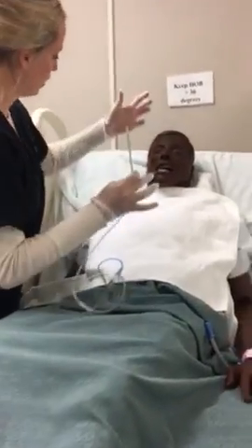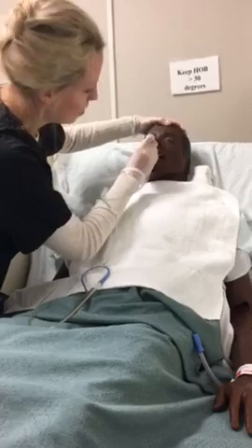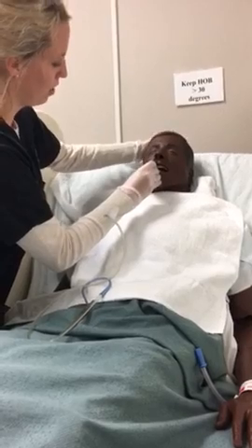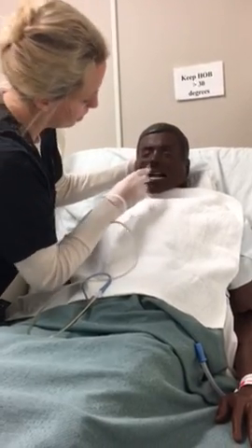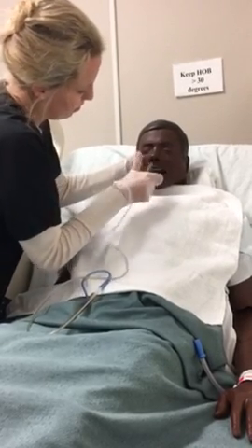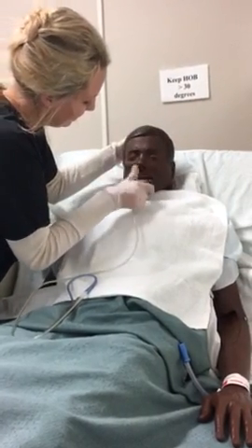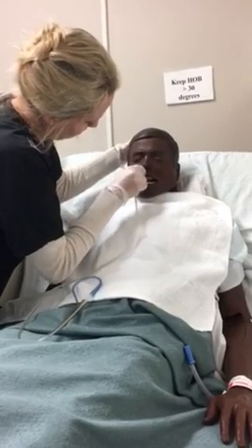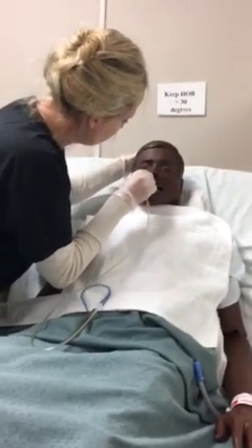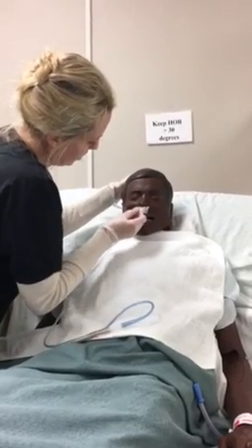I'm going to have the patient tilt their head back, and then I'm going to advance it forward. When the patient starts to gag, give them a minute, pull back a little bit, let them recover, and then have them tilt their head forward, and go ahead and drink, swallow, swallow, swallow. And if it gets hung up, you want to make sure too that it's not getting coiled up in the mouth. You're going to keep advancing forward until you reach the marking.